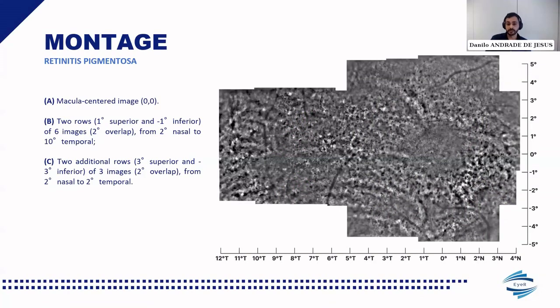When we talk about standardization, we can talk about standardization in terms of image acquisition, or standardization in terms of image annotation, or even in terms of image interpretation. All of these are needed and important in AO imaging, so we can not only maximize the information we want to retrieve from these images, but also assure the reproducibility of our results. That said, the design of the image acquisition protocol was something we paid special attention to at the early stage of the project.